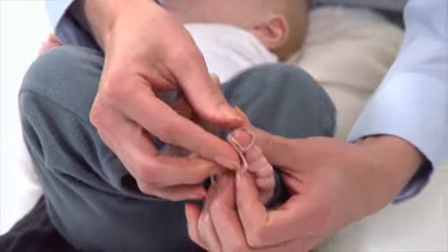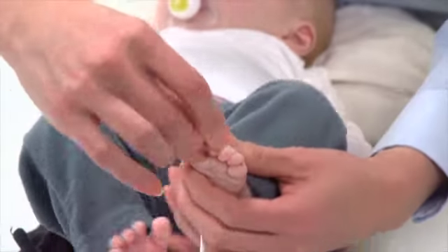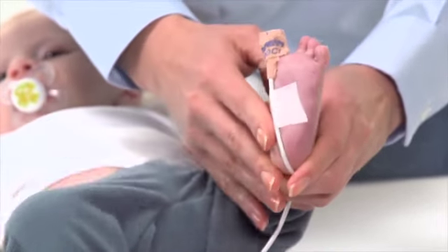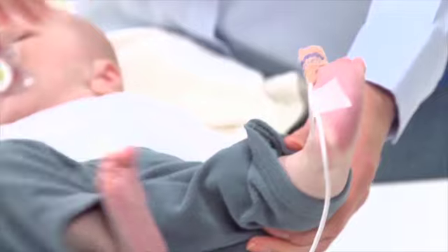Gently wrap the tab around the toe to overlap and secure the sensor to the toe. It's a good idea to gently secure the sensor cable independently from the sensor along the bottom of the foot toward the heel.